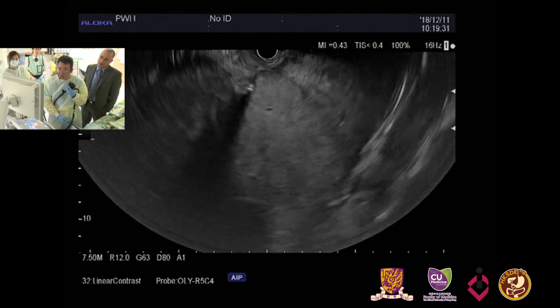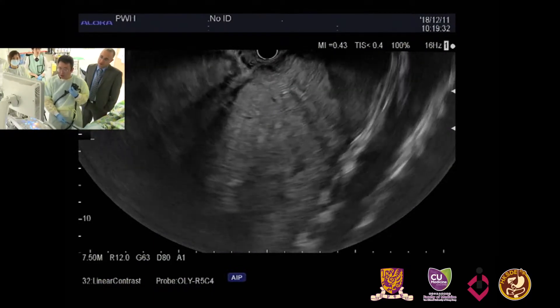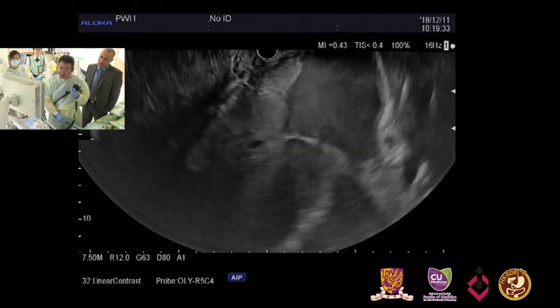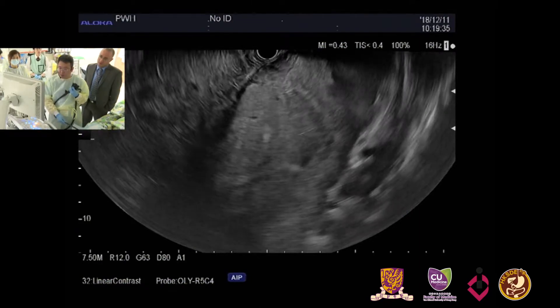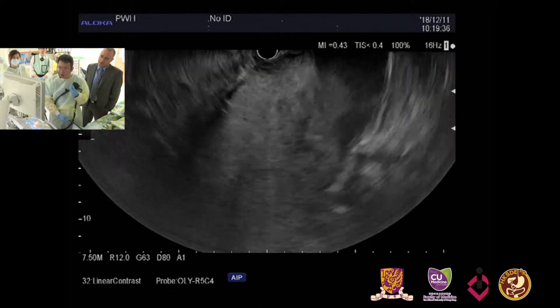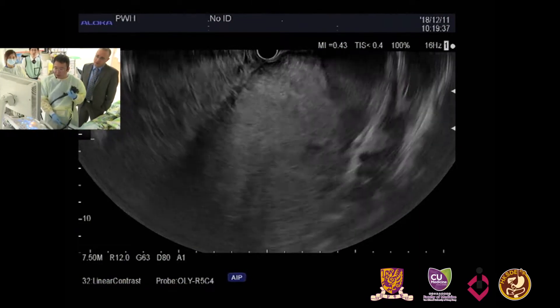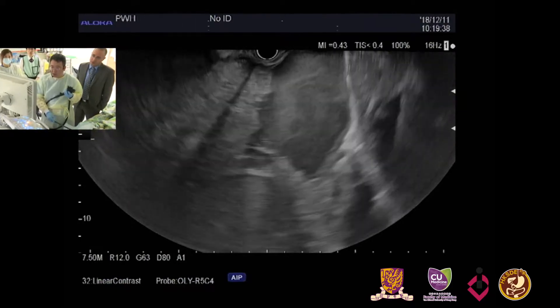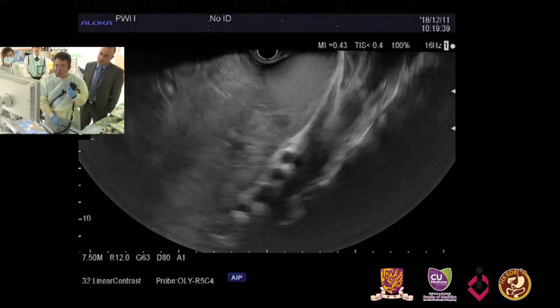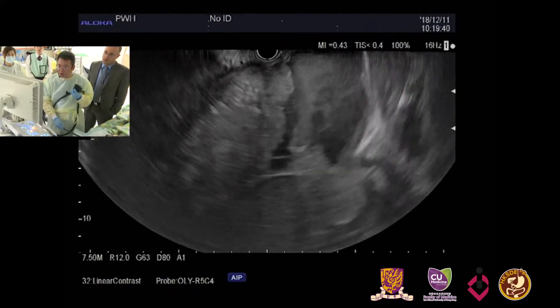However, we have to look at whether this originates from the stomach or the pancreas. Now I will show the ultrasound picture.